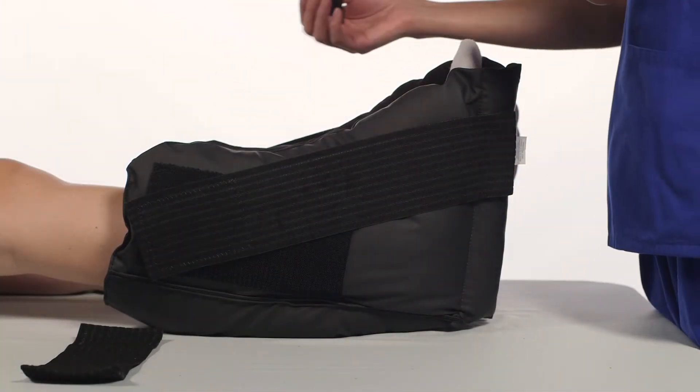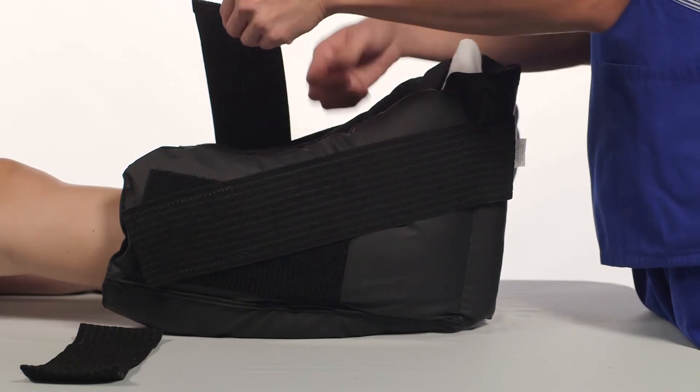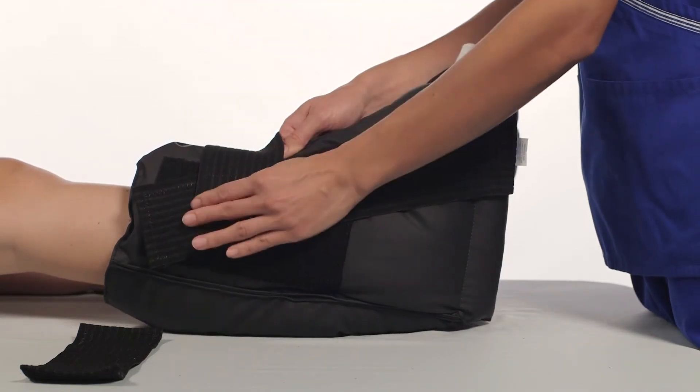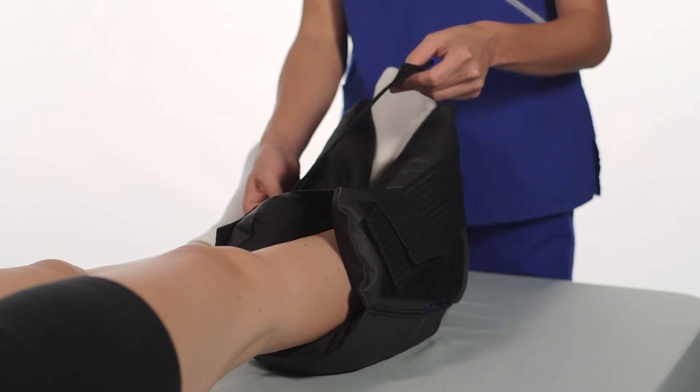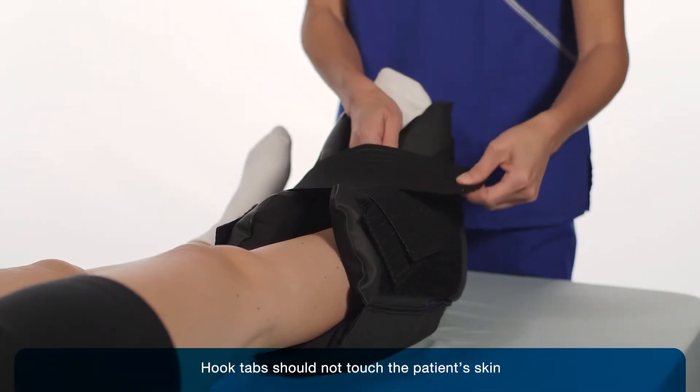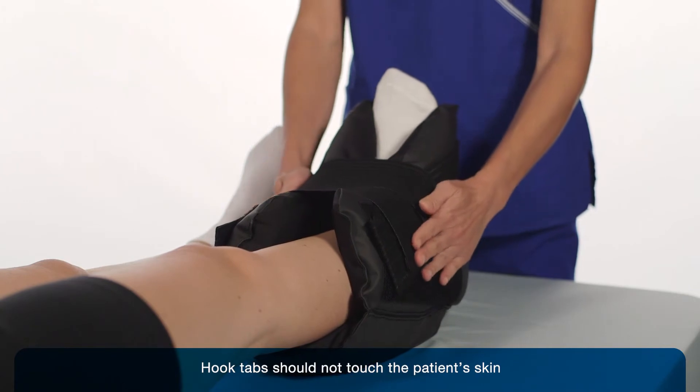For a more secure application, use the accessory straps and place them over the top of the leg. Secure hook tabs to either side of the boot. Hook tabs should not touch the patient's skin.